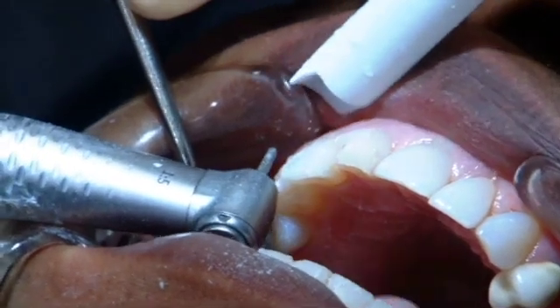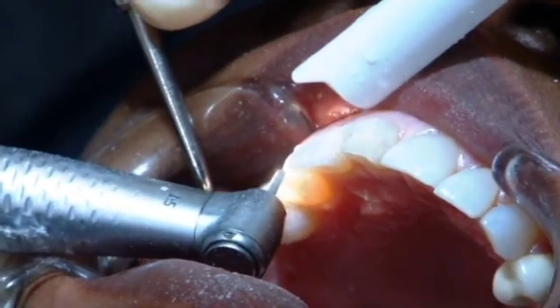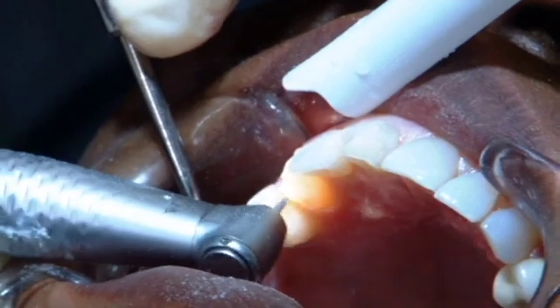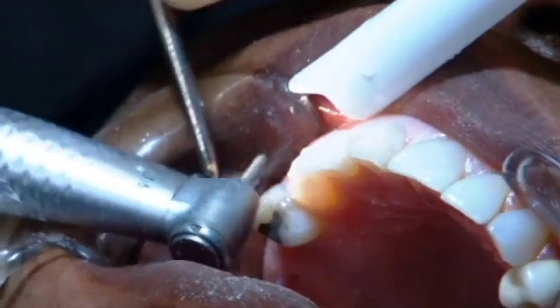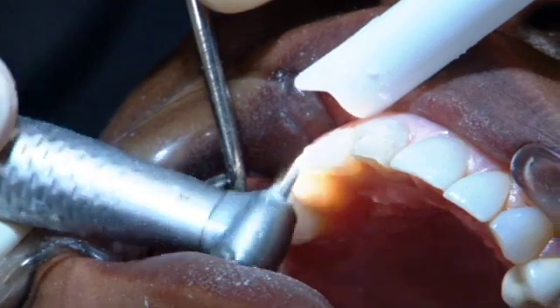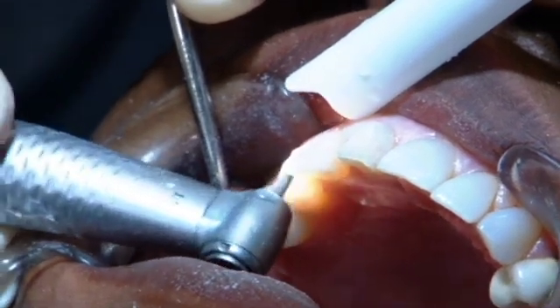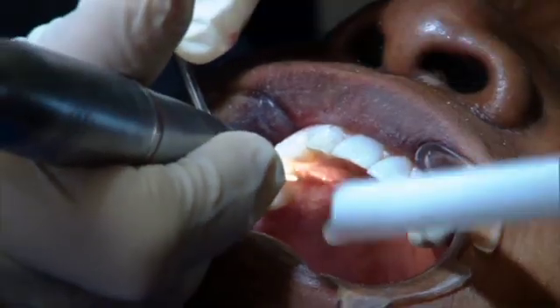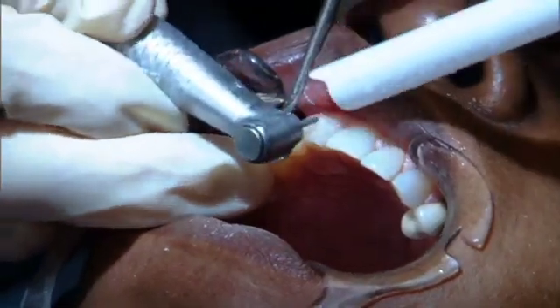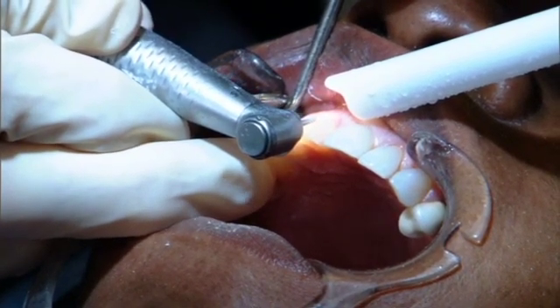We can then jump over, now open back up a little bit, to the canine and do the same thing. Using the tip of my burr as a depth cutter, I would encourage you to try this because it will ensure that you get your two-plane reduction. Now all I've got to do is come out to the labial surface and the gingival. Now I can prepare it just like we would have in the old days conventionally.